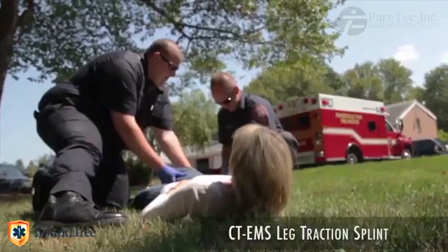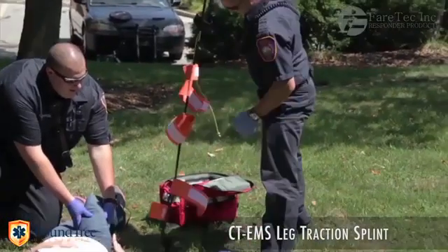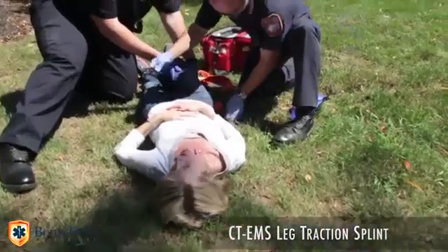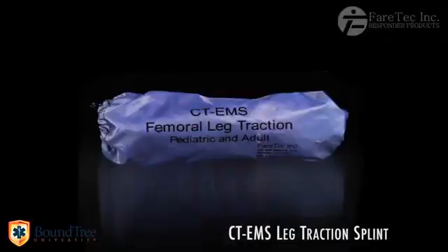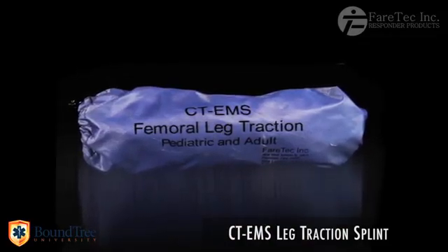The goal was to create a splint that was light and compact, rugged and extremely functional for all sized patients during critical situations. The CT-EMS weighs about one pound, measures 11 inches in length, and has a diameter of 4 inches.